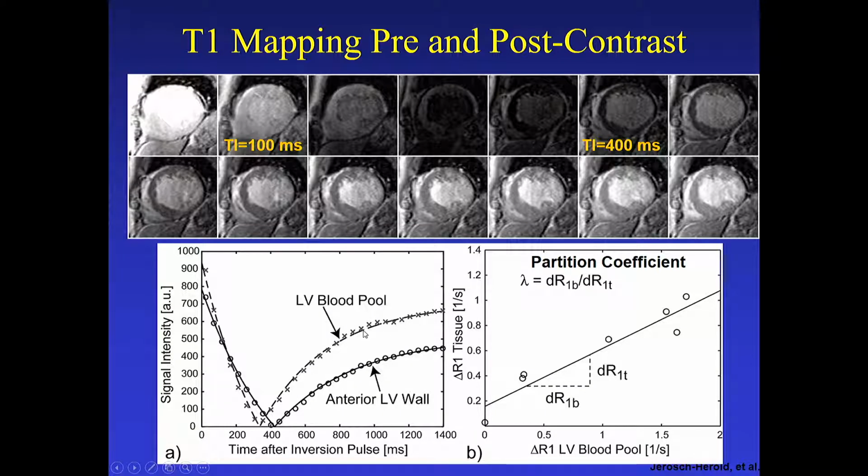That is a unique physical property of a tissue. By quantifying that, you can then derive the amount or severity of pathology, such as fibrosis and so forth. So this is something that is increasingly used clinically, and most of the time is to look at edema or fibrosis.